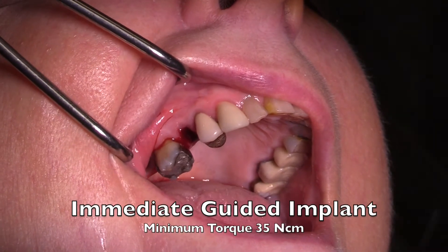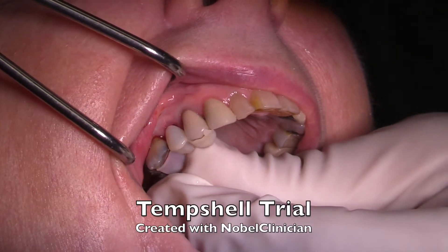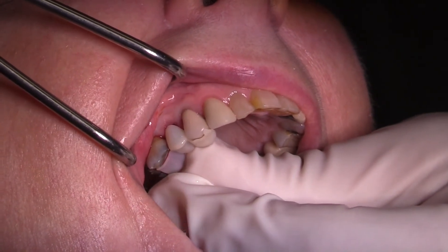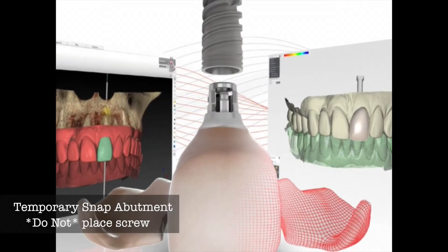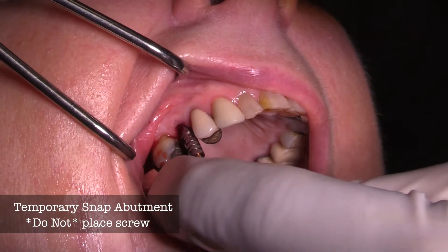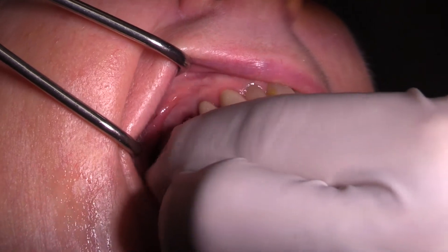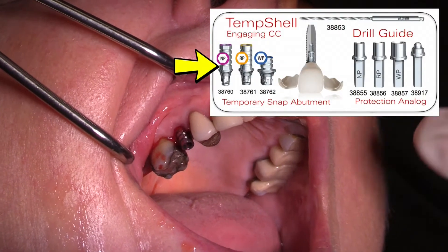We need to have an implant that has 35 newton torque minimum — this one has 70. It's a Nobel Active implant. You can see the temshell fits beautifully in place. This is all fabricated prior to the patient coming in. On the day, the tooth was extracted, the implant was placed, and now the temshell is going to be fabricated. We're using a Nobel Guide to place the implant.